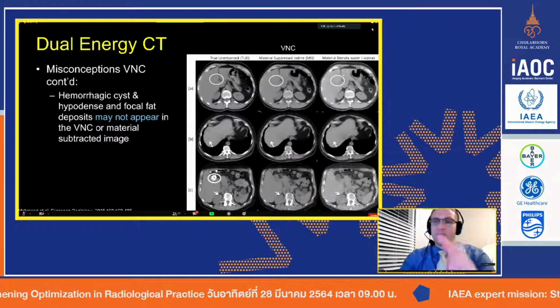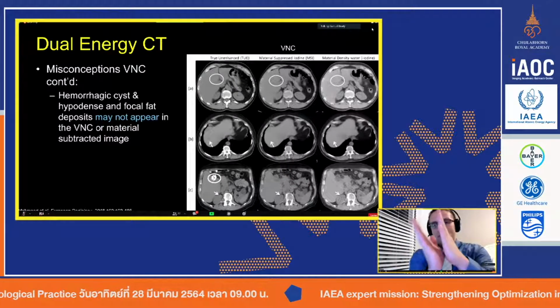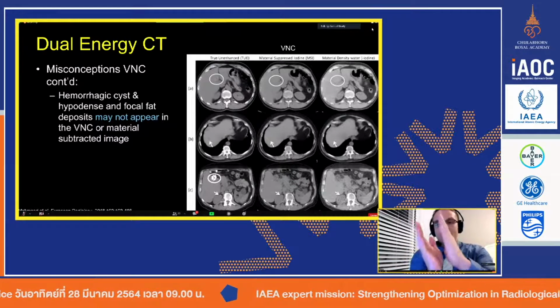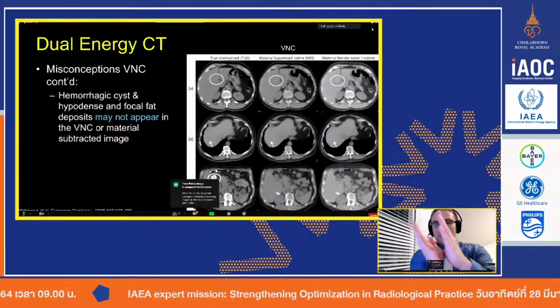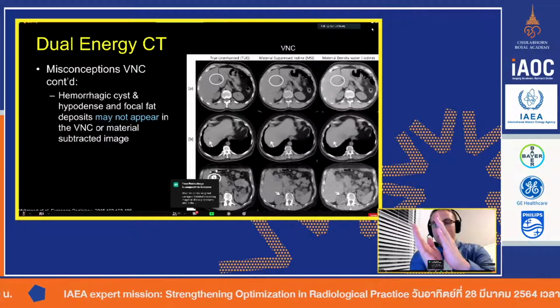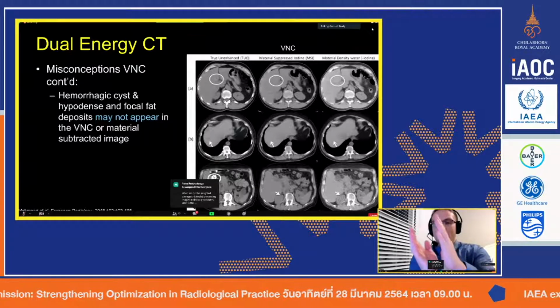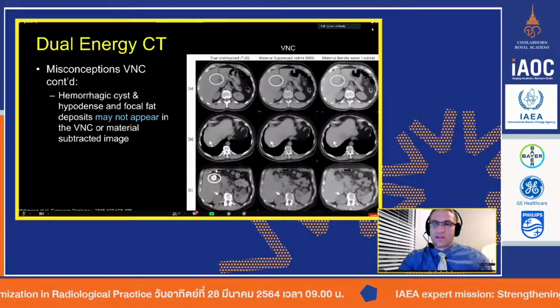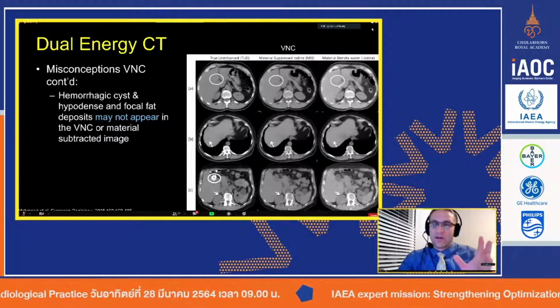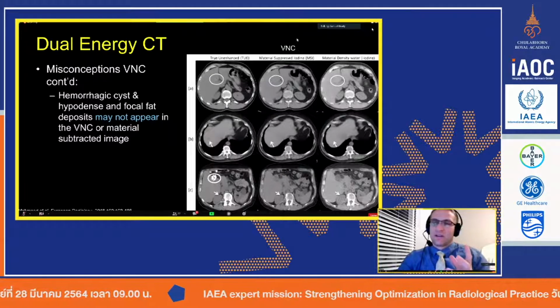Different ways. Once we've identified which tissue, if we remember those two curves, if we're trying to identify iodine as one of those curves and maybe soft tissue or water as another curve, well, what we can do is a plot where we simply look at the density of water, or we could do the density of iodine. So it's subtly different than the virtual non-contrast.